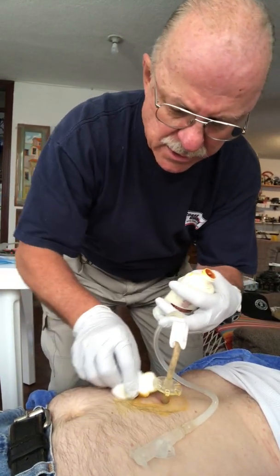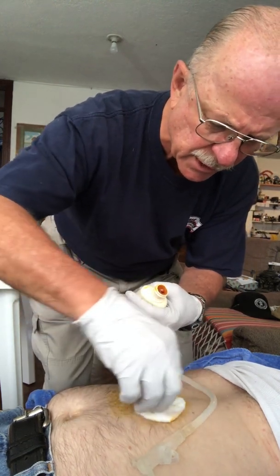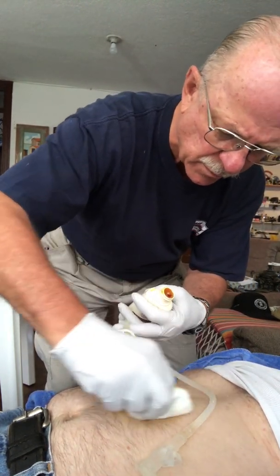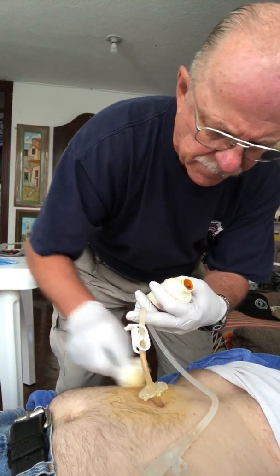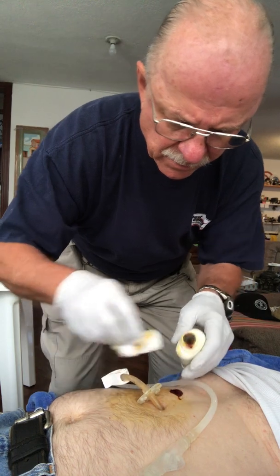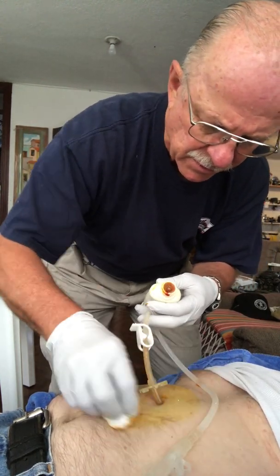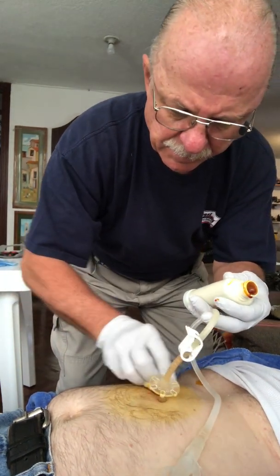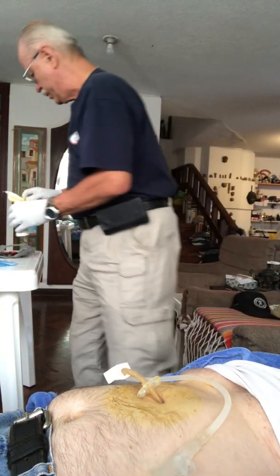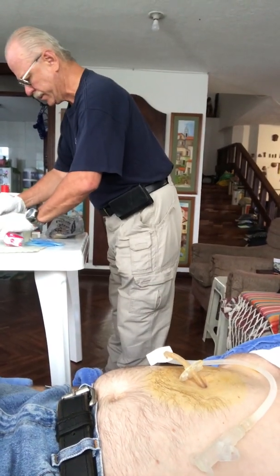This is antiseptic soap that they use during surgery in the surgical environment. So this is how they prep it, and they kind of go around. It's kind of like washing it with soap and water, but better. Let's get a little more in there. Big area here. Okay, so in here too. Next I'm going to apply the betadine solution. I'm going to use this bag for trash. Absolutely.